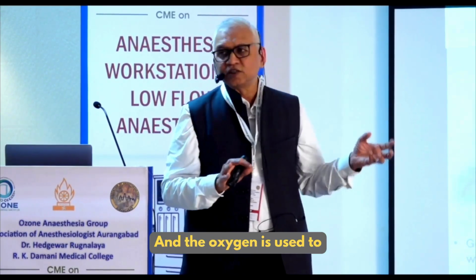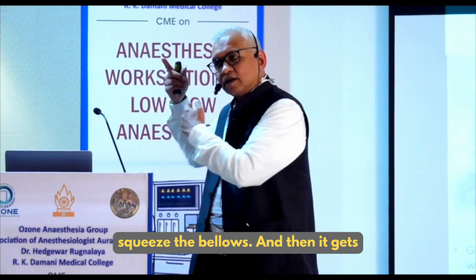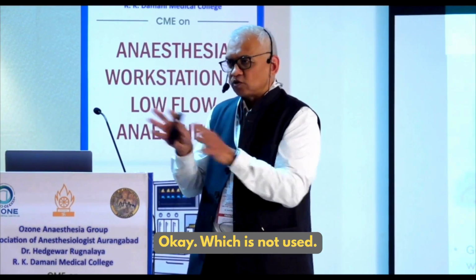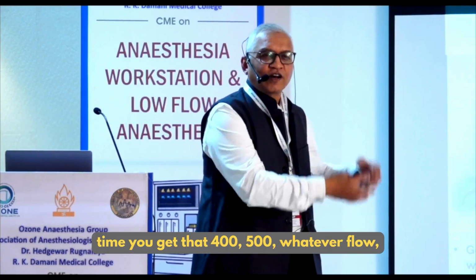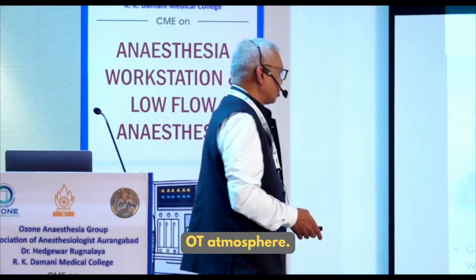The oxygen squeezes the bellows and then gets out into the atmosphere, which is not used. So the operation theater atmosphere is enriched with oxygen, because every time that 400 or 500 ml flow volume is released into the OT atmosphere.